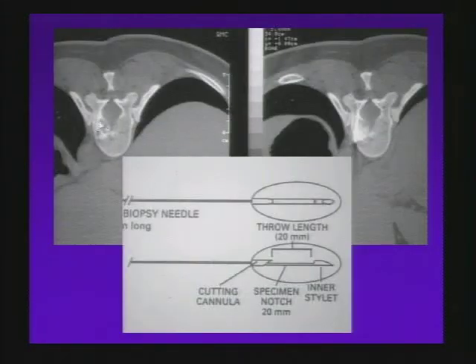This was somebody who had this solitary lesion, and we went in, and sometimes they want cores. We went in transpedicular. I used a cutting needle, measured carefully. If I'd shot the cutting needle here, I might have gotten a blood gas out of the aorta. But pulled back, got some nice cores with this type of device. And it turned out to be breast cancer.